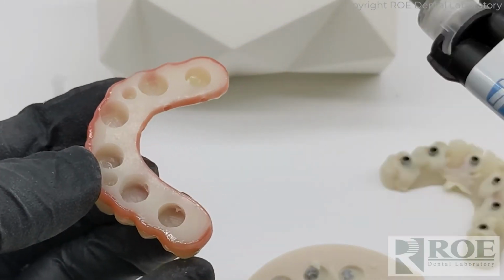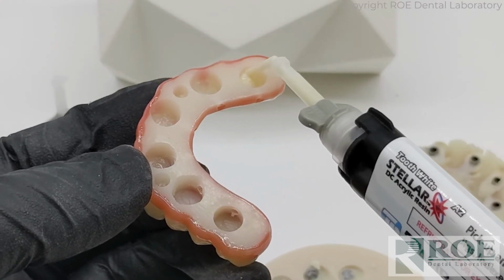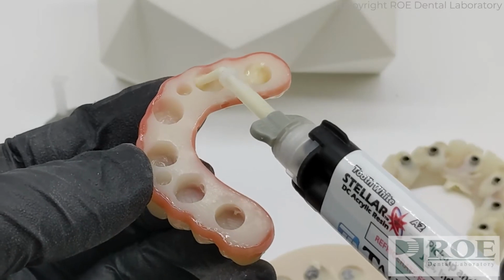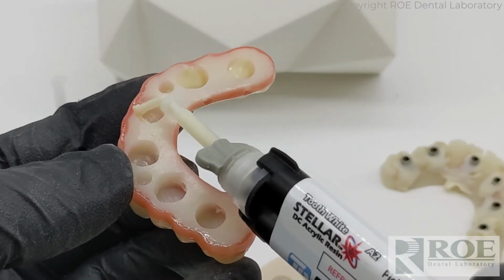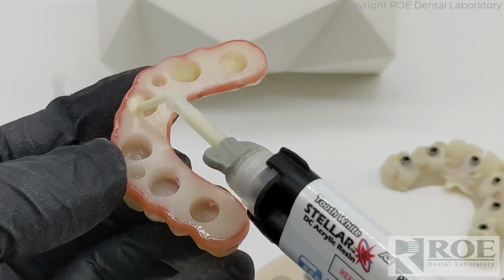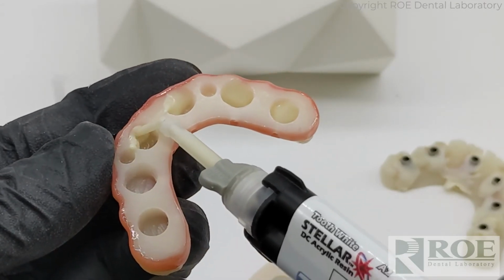load the wells. And we're going to load on the labial right up to the edge. And you only want to fill a well up maybe a third of the way. I think Dr. Olson gives little tips on how much to fill it. But just on the labial, do about 1/3. You can see it's about 1/3 of the well.